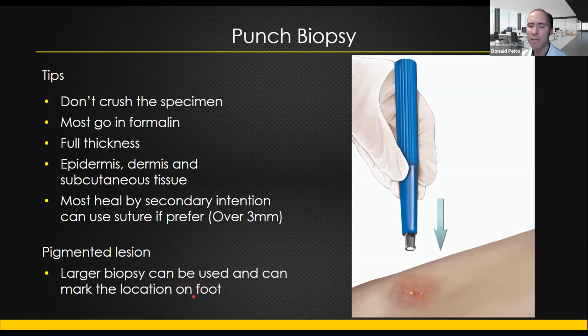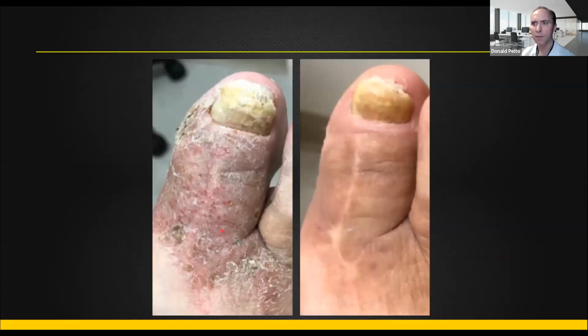Nowadays we take pictures. So you take a picture and you mark where it's at. You can put a suture in it to say the one that's at the 12 o'clock position or whatever position. Taking a picture and sending that with it is very easy in your EMR. Download it and send it to the pathology lab as an attachment, especially if you're concerned of a melanoma. So some examples here.